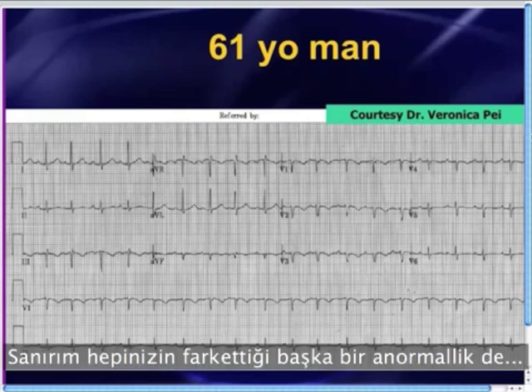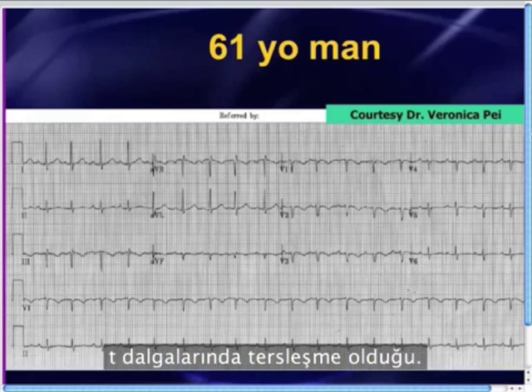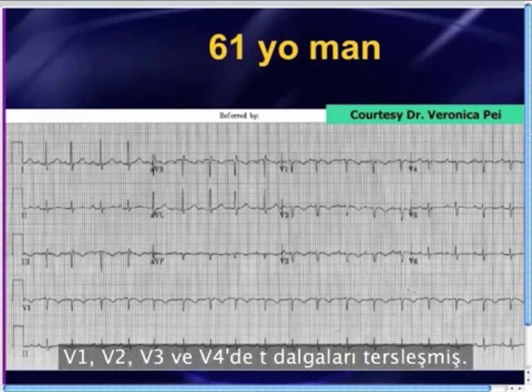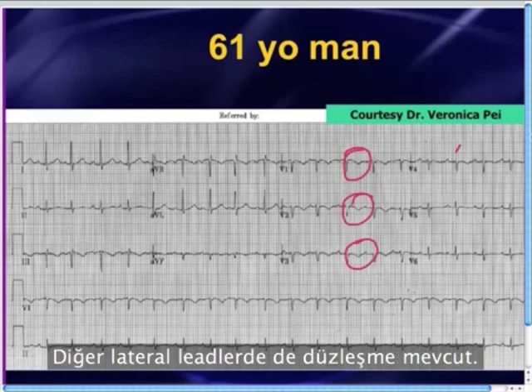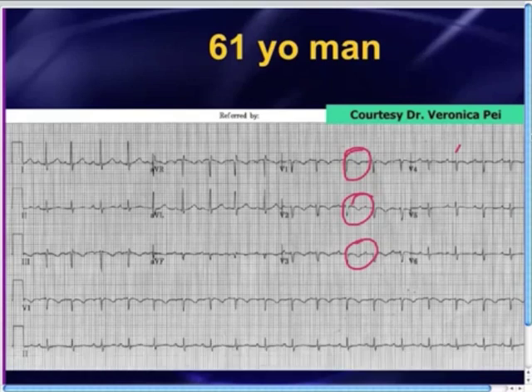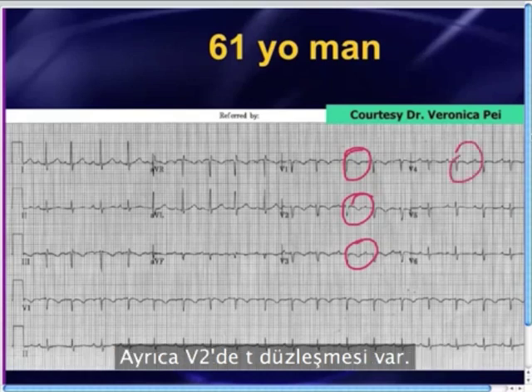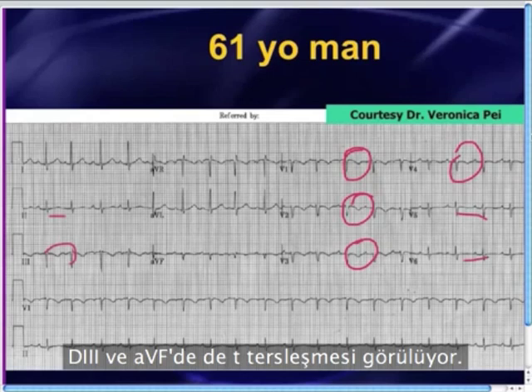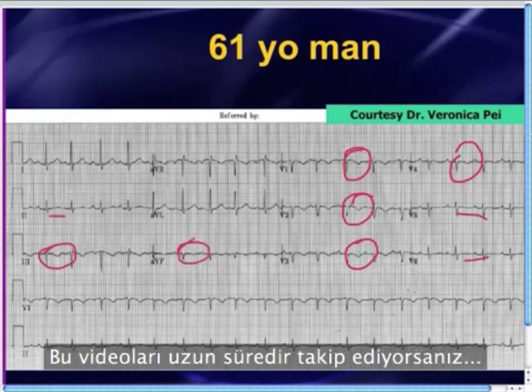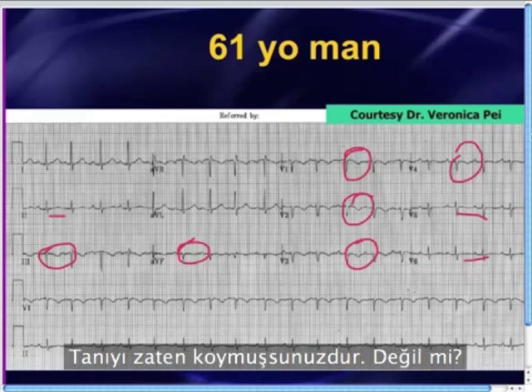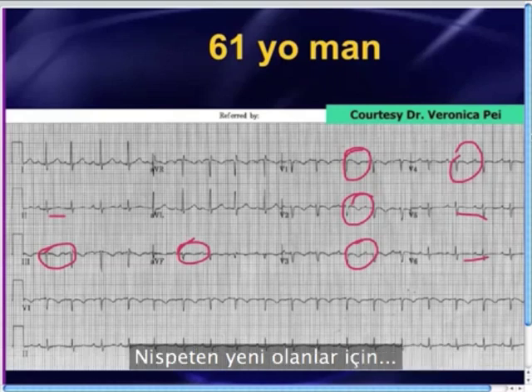The other major abnormality that probably everybody out there is noticing is T-wave inversions. There are T-wave inversions in V1, V2, V3, V4. There's some flattening in the other lateral leads. There's also T-wave flattening in lead two, and T-wave inversions in lead three and AVF. Now, if any of you have been longtime listeners or watchers of the videocast, you probably know the diagnosis already.